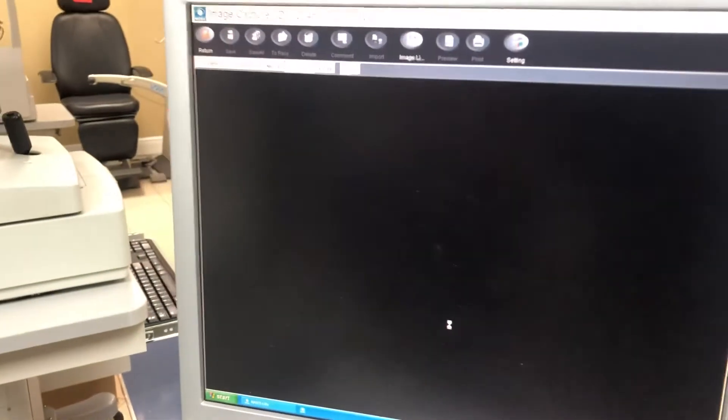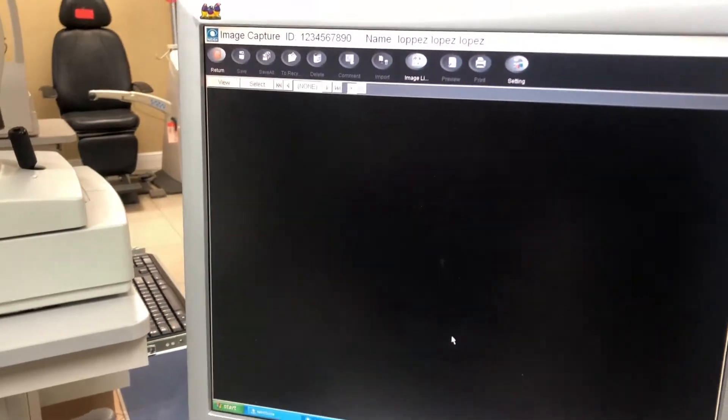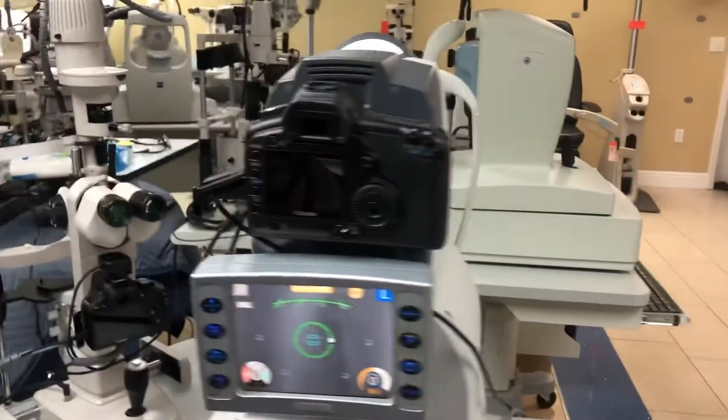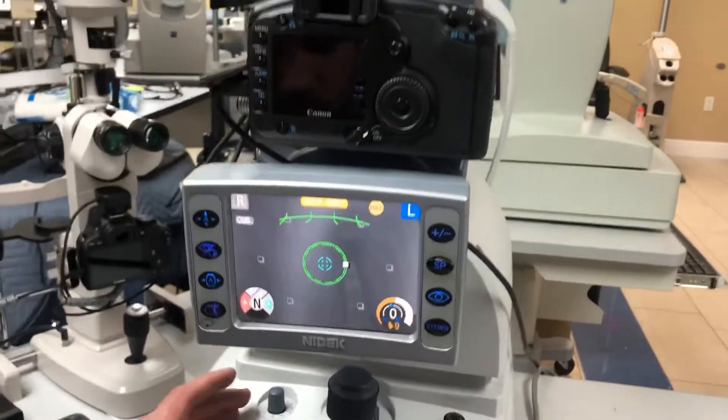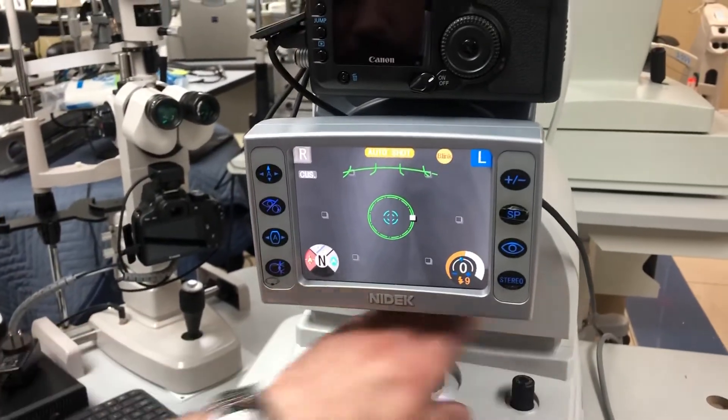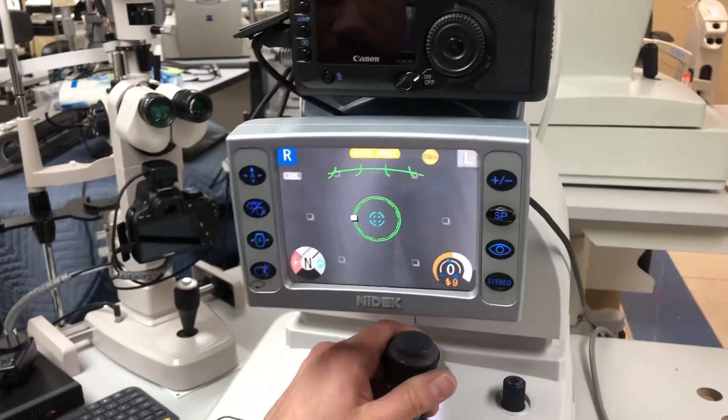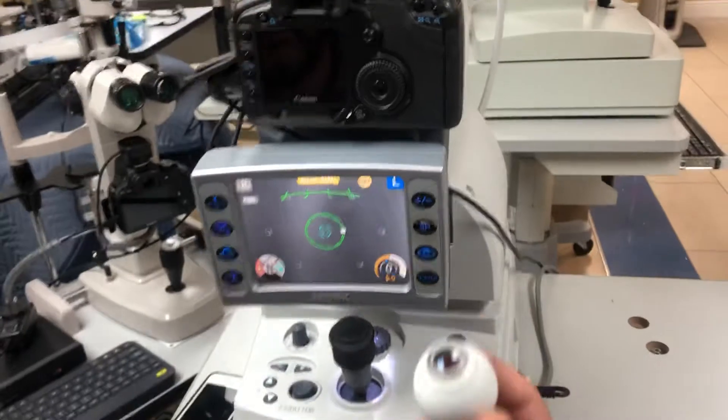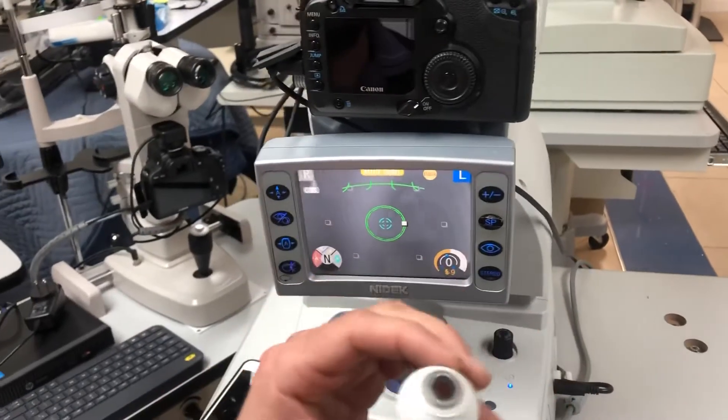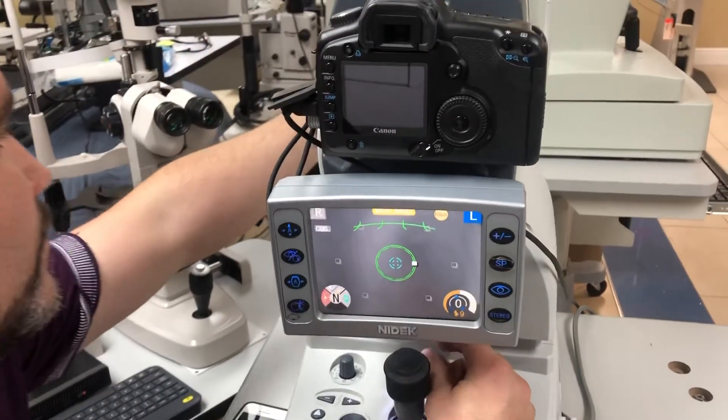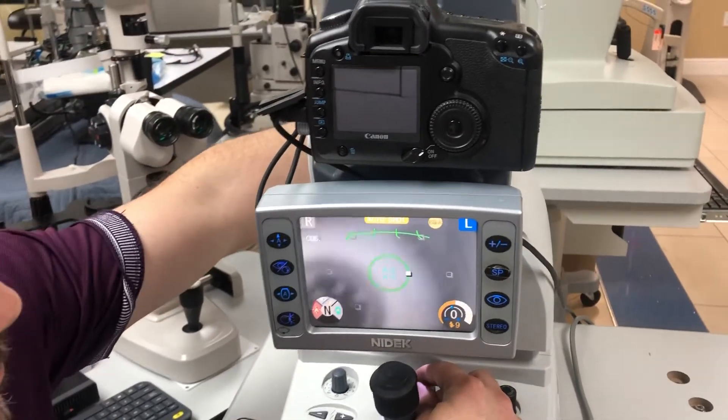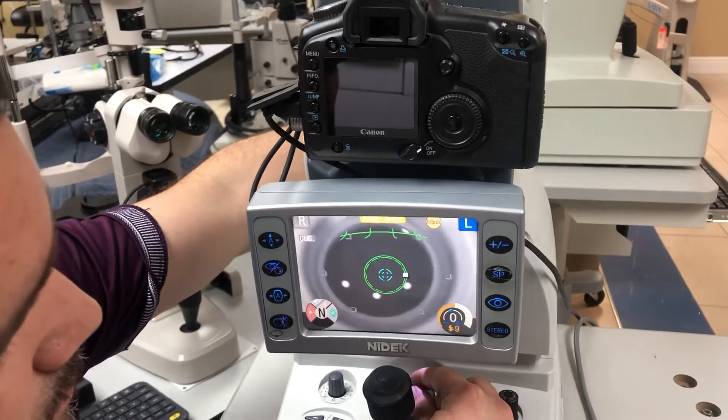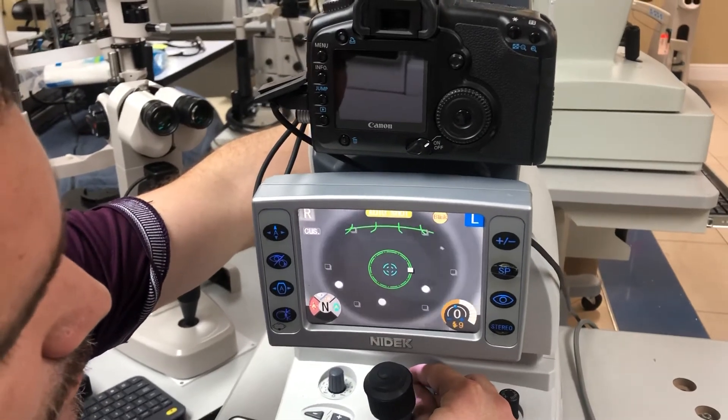Once the screen goes black, that means we're in capture mode. As you look here, we're going to show you the device itself. We're going to use an artificial eye to do a quick exam.